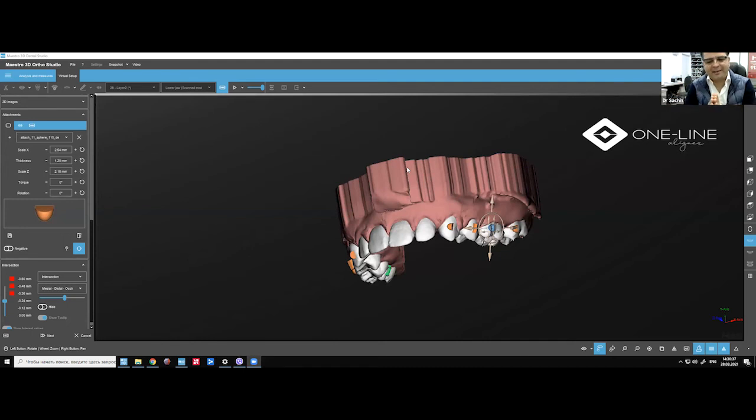So remember, aligners are push. If there is no push from the sides, it will not work. If you just push here, it will just go up on the posterior. It's like you're pushing here and there's no retention, so this will go up. This will not push down. It's very simple.